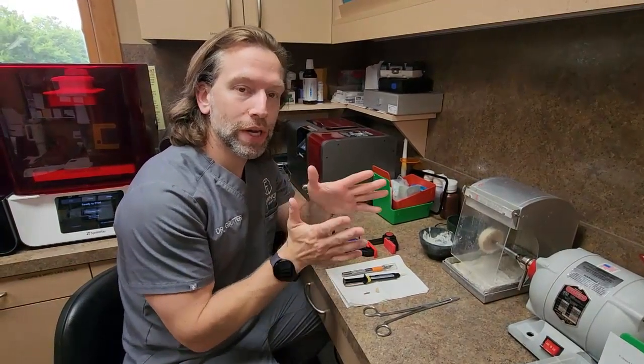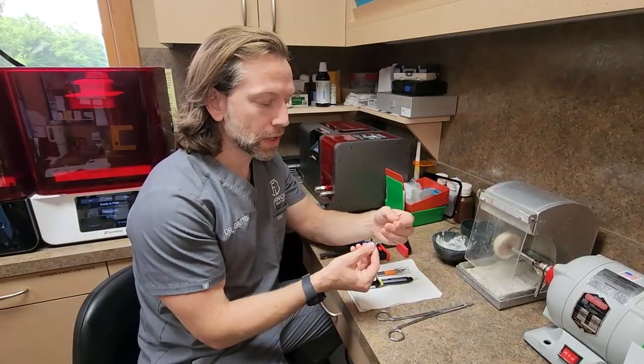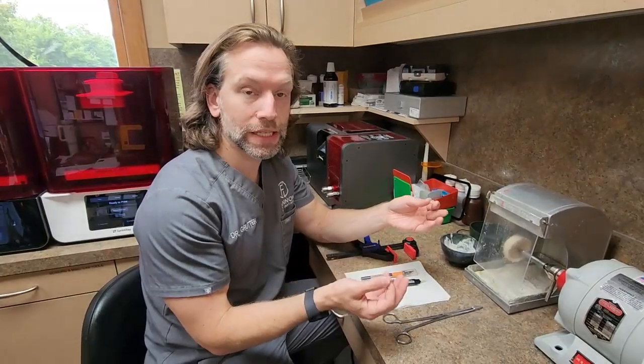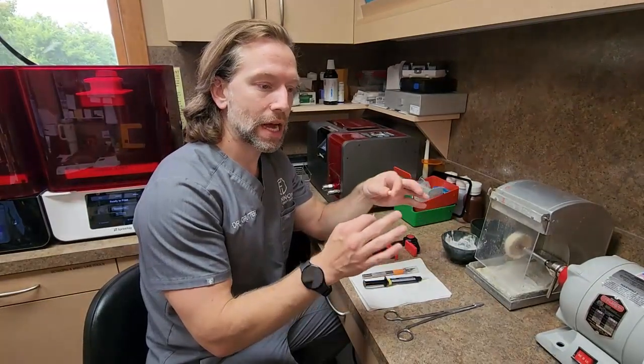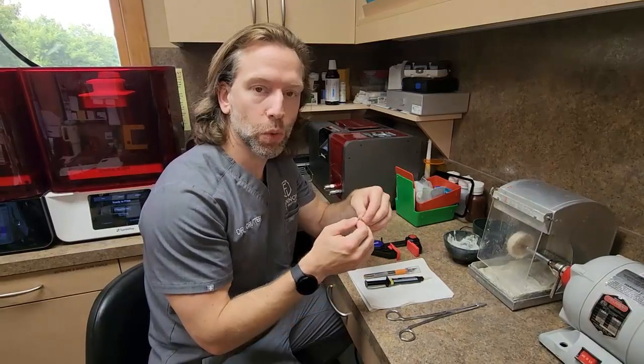I'm going to make a quick video showing how to cement a crown onto a tie base. A lot of you may already know this, and it may be kind of old news, but just in case it's not, this is a technique that I initially learned from Michael Scramstad throughout the CEREC workflow.